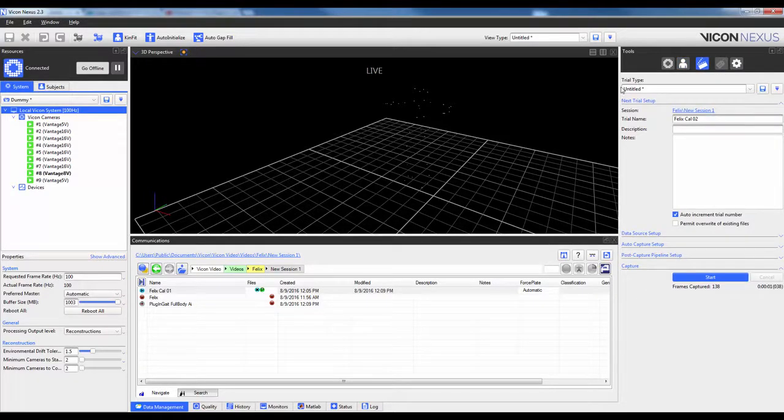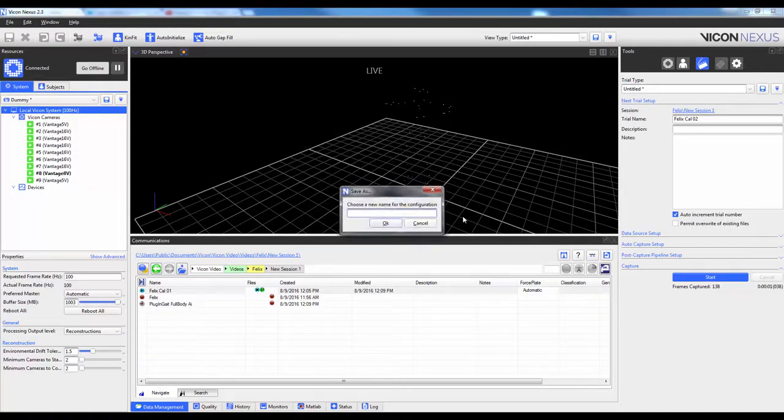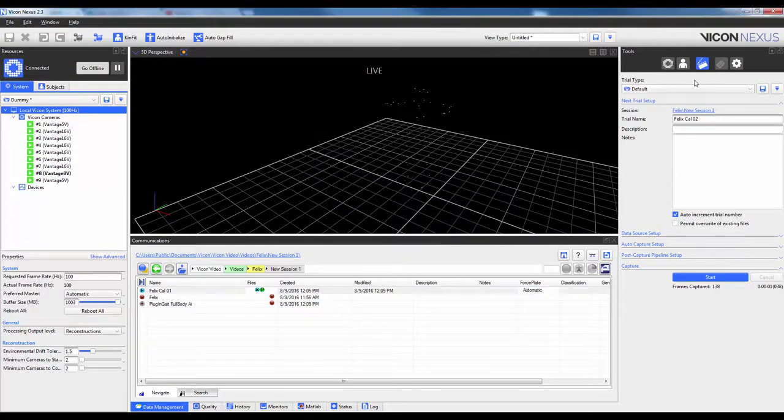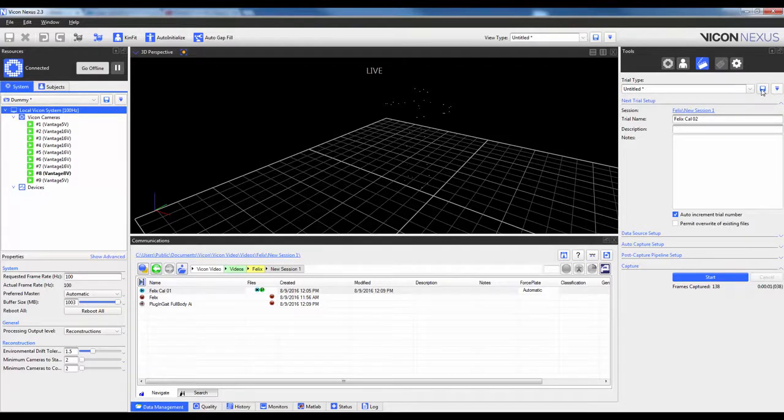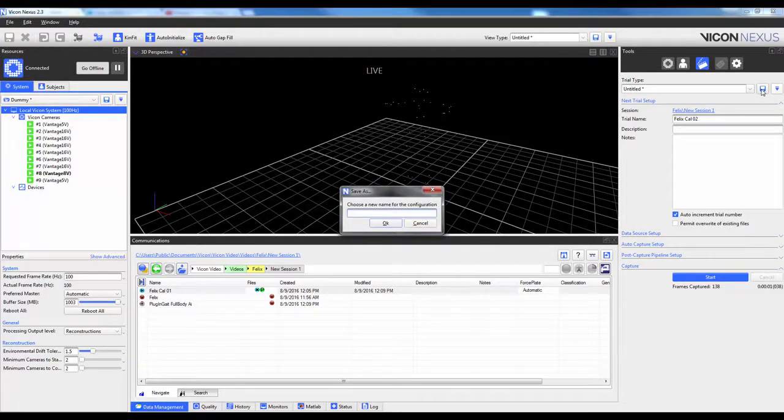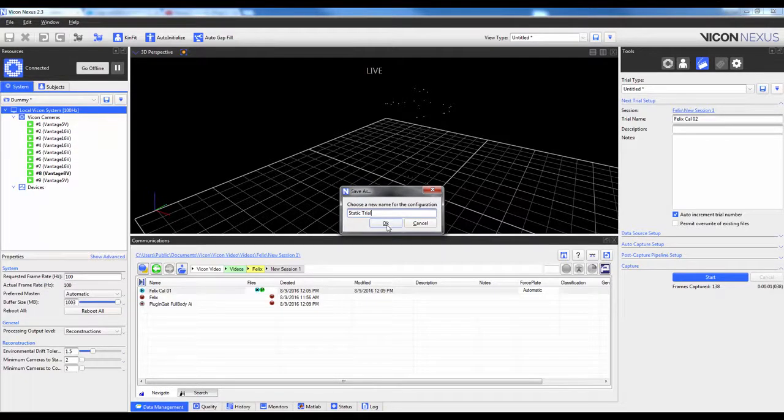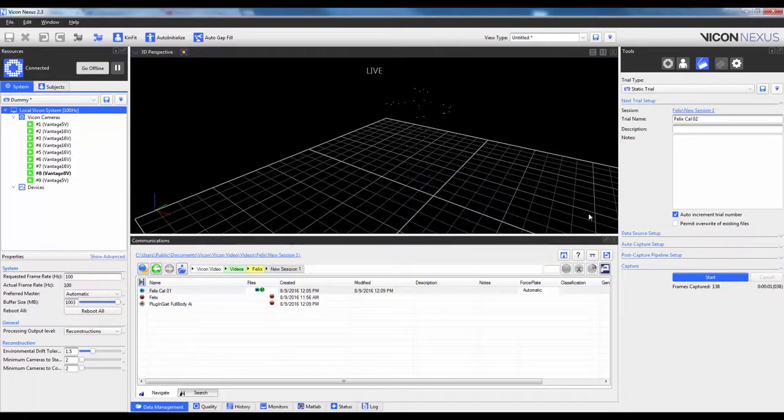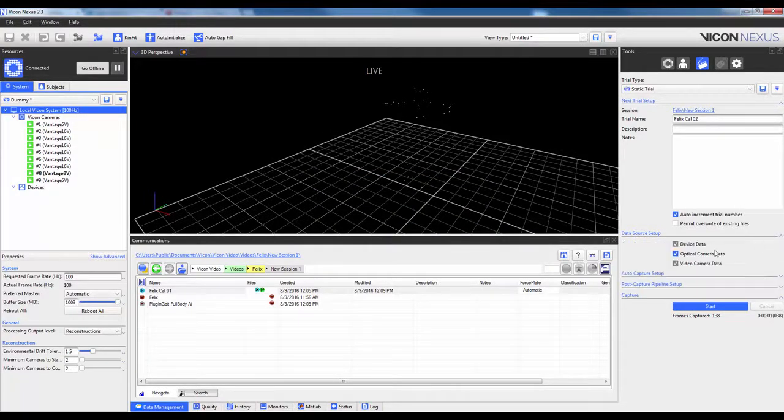First, I will save a trial type that's going to be called Default, something that has zero settings in it. So I'll go ahead and press the Save icon and select Default, and again, I'll make that Shared. I can then go ahead and make a new trial type, and again, I will call this something that will make me think of being Static Trial. So here I can just call it Static Trial. Again, I will just make this Shared.